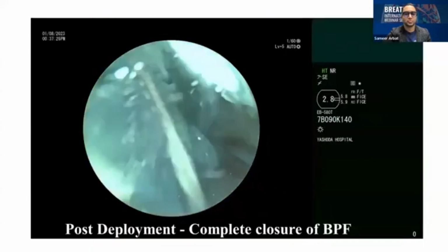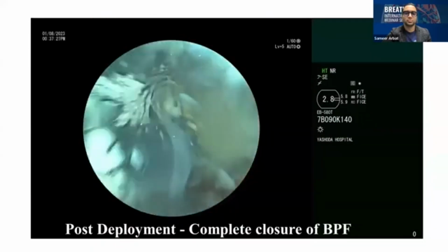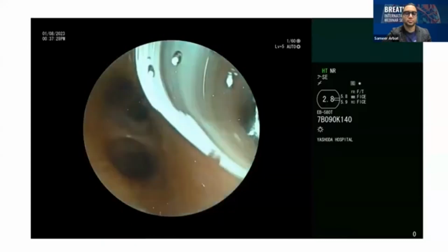And once the silicone Y stent is placed, you can see that the infected pleura is completely secluded from the normal lung. Thereby, it prevents the contamination of the normal lung with the infected content from the right-sided pleural cavity. So in certain cases of silicone Y stenting, your rigid bronchoscopy comes to the rescue.